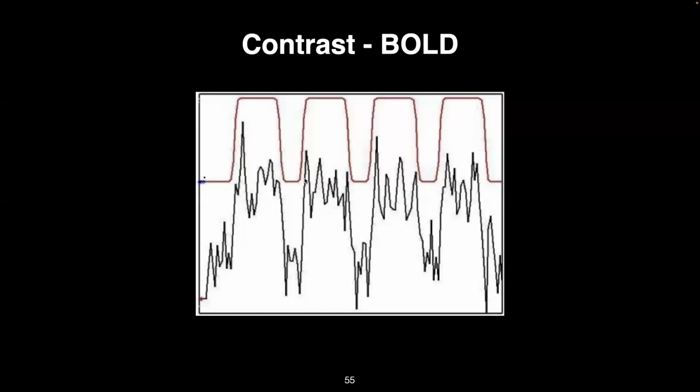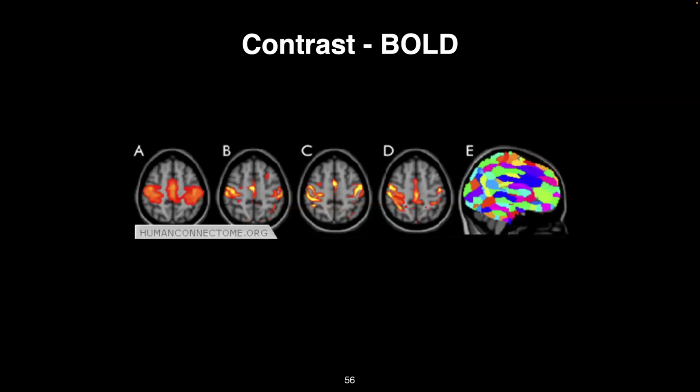And then when the brain is working, doing a task, there's more oxygen, more oxyhemoglobin supplied, the field is more uniform, so the signal remains higher. And then we do that over space and do our statistics properly, and you start to get maps that look like this for brain function.